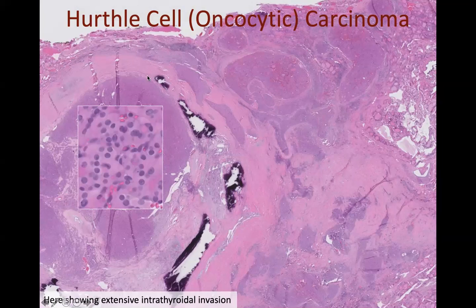And sometimes on ultrasonography, I believe you may see these calcs in the capsule, maybe called eggshell calcifications. You can see these types of calcifications in both benign and malignant lesions. It's not diagnostic of malignancy, but it is essentially diagnostic of the presence of a capsule and capsular calcifications. So it's these cases that we certainly want to evaluate critically, histologically for invasion through the capsule, but some of them end up not having invasion and just being benign. Some of them end up having invasion, being malignant. So just a word on those.